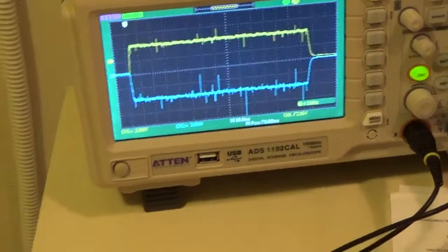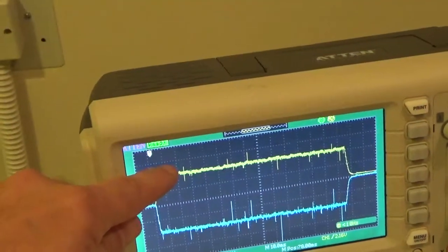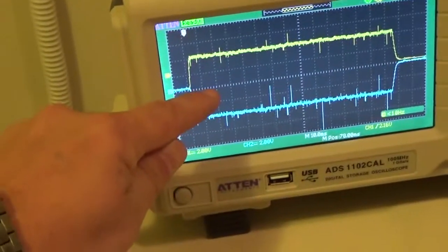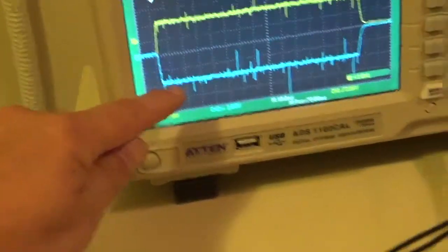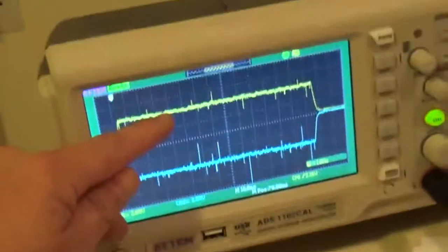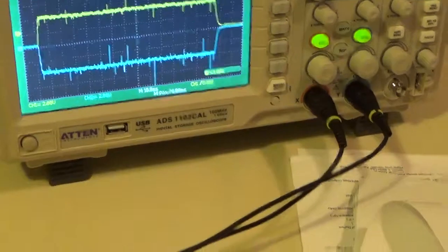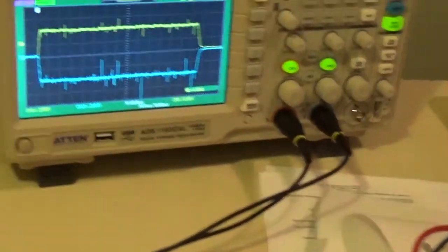So if I go from the center, 20, 40. So my anode is 40. 20, 40 negative. So my cathode is 40. 40 and 40, 80 kV. So I got 20, 40, 60, 80 kV. Or as you say, if you subtract them, that gets a zero. So what do we have selected? 80 kV.